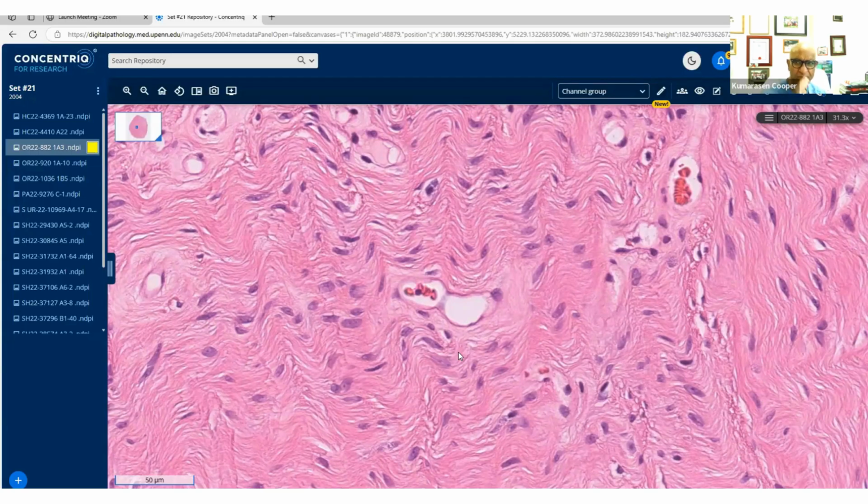Okay. Yeah, that's exactly what it is, Janet. A nice cellular angiofibroma. Any questions or comments?